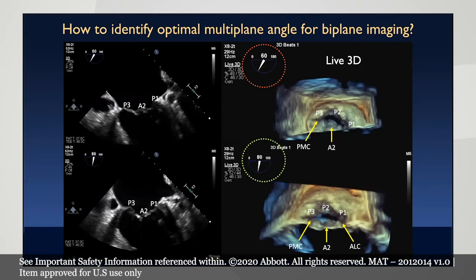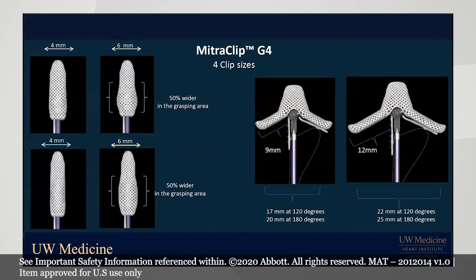And I think for the rest of the procedure, I'm pretty confident I can use this 80-degree angle, with a bit of a rotation of the heart, as my baseline bicommissural view to then use biplane imaging and get a nice long axis view on the right-hand side.